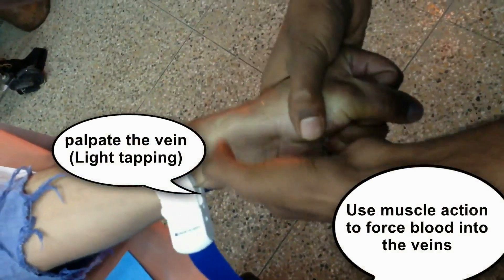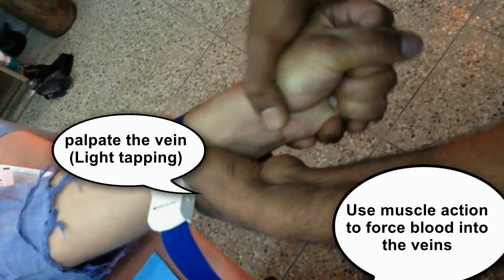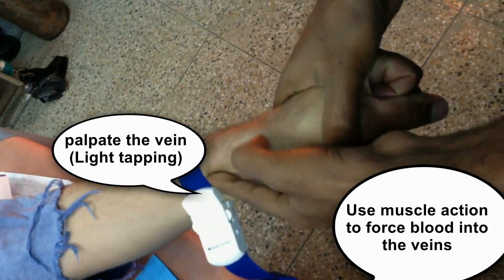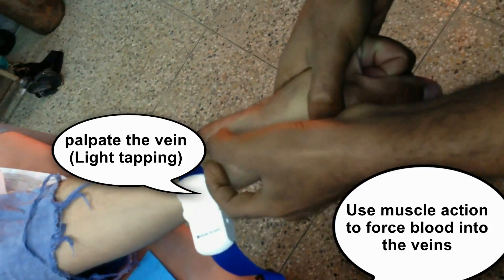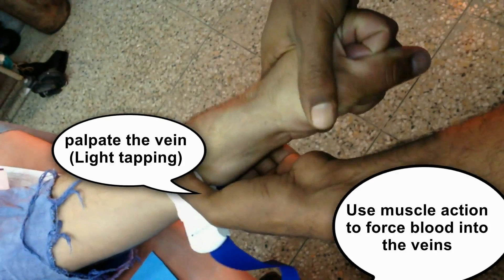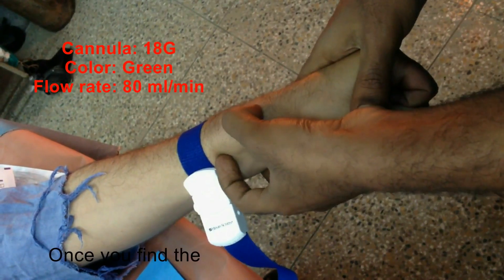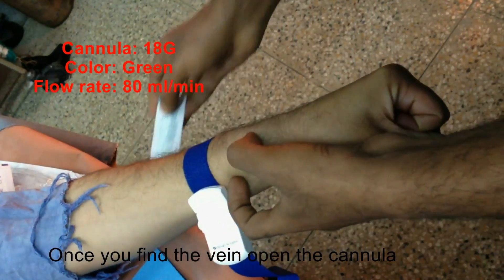Palpate the vein by doing light tapping, and use muscle action to force the blood into the veins. This can look slightly difficult because the vein is not visible. You can use the palpation technique in this kind of patient. Once when you find the vein, open the cannula.